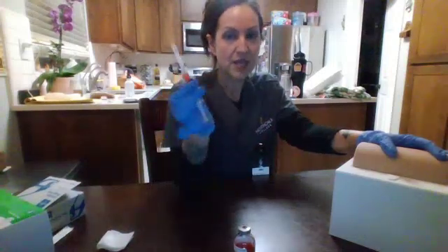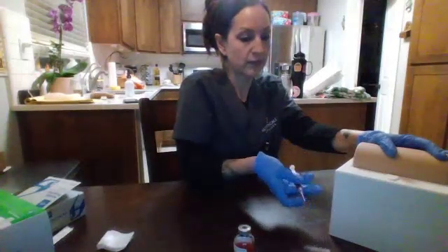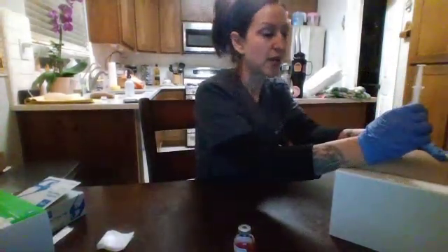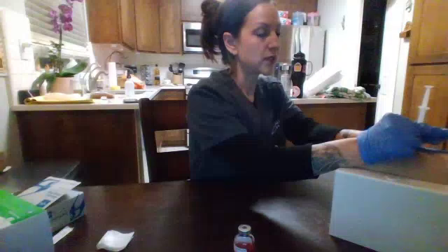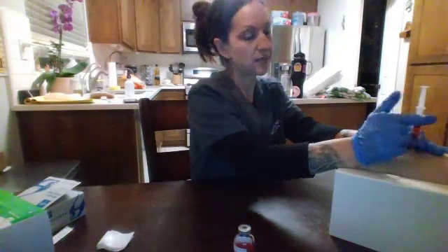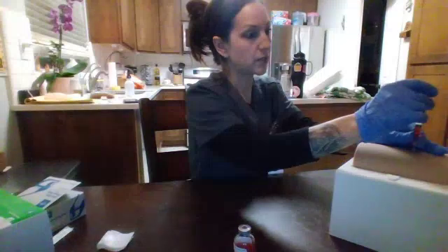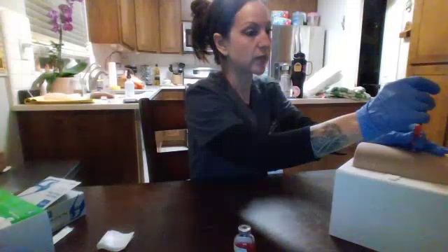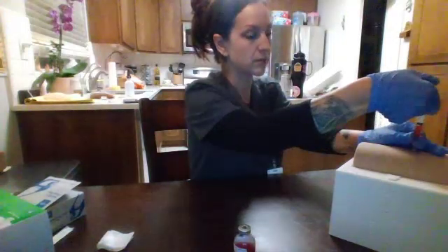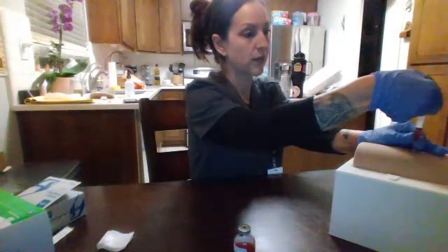With my dominant hand, I'm going to take the syringe between my forefinger and my thumb. I'm going to carefully remove the cap. At a 90-degree angle, I'm going to insert the needle. I'm going to stabilize using my non-dominant hand by grasping the lower end of the syringe barrel. I'm going to take my dominant hand and pull the plunger back for about 5 to 10 seconds. If I do not see any blood, then I'm going to inject the medication slowly, about 10 seconds per ml.